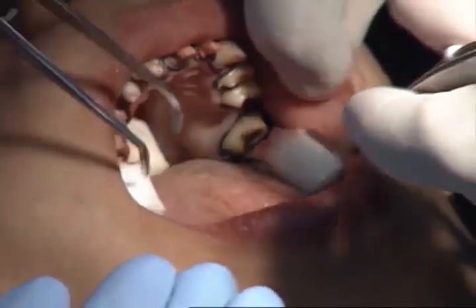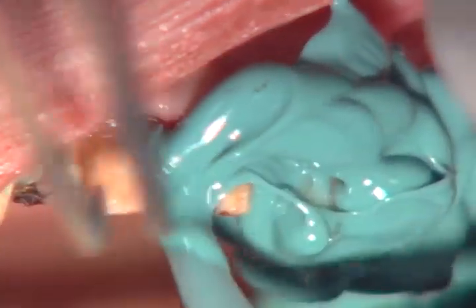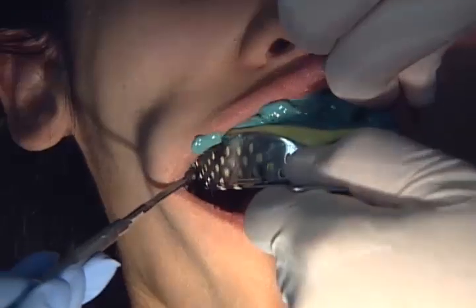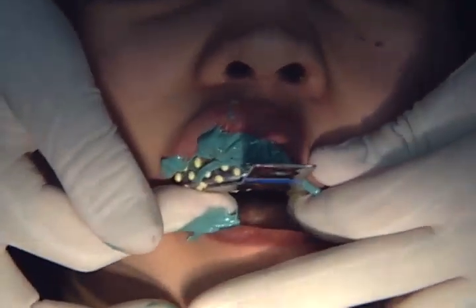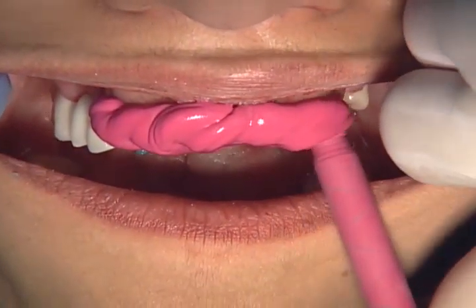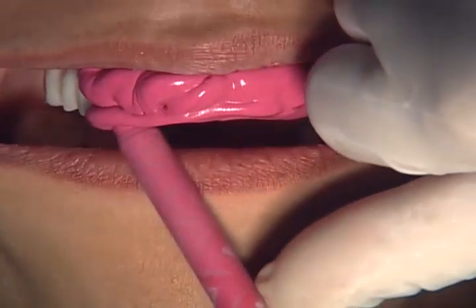And we're now removing these in anticipation for taking our master impression. And the top cord comes out, and this is a rare sight. You usually don't see much bleeding when you do this technique, but this patient definitely had some periodontal issues. She was on a time frame to get back to Europe, and we weren't able to work her through our periodontal program like we ordinarily would. This is not ideal dentistry here, and there's just times where this is how it has to be done.